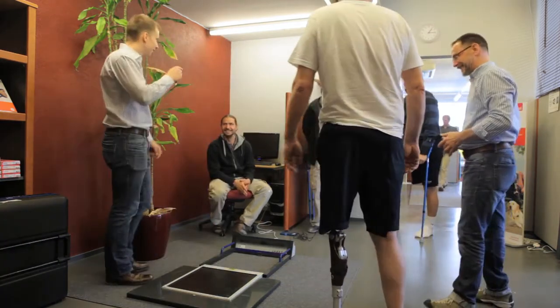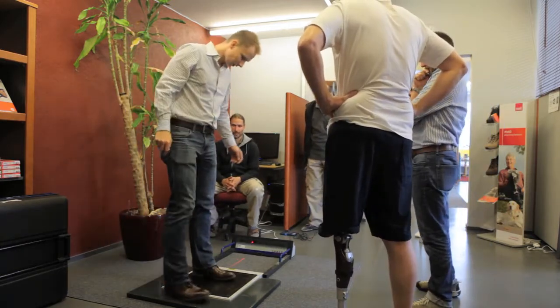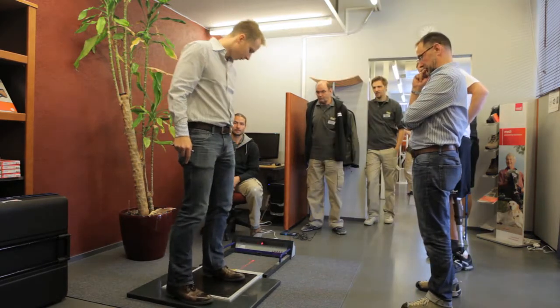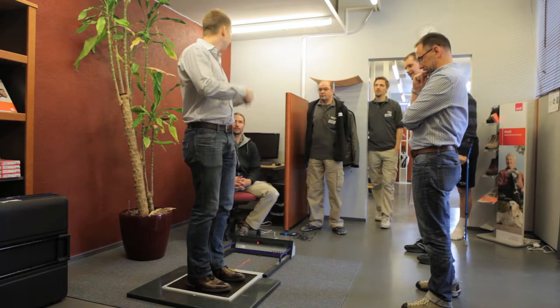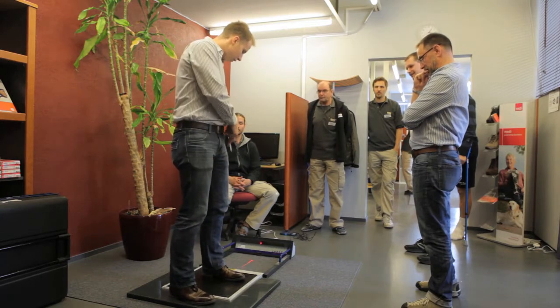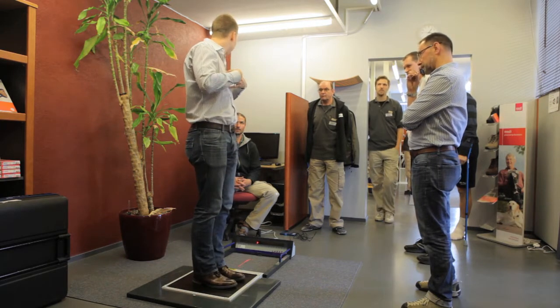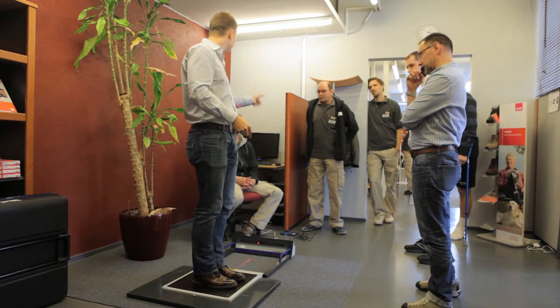The idea of the whole measurement: on the prosthetic side, I'm perfectly aligned. When I now step with both feet, do you see a difference? Because I have a perfect alignment situation here, so that means if I'm measuring the prosthetic side, I have the same alignment as if I'm measuring my whole body point of pressure. So I have almost zero millimeter difference — that means good.